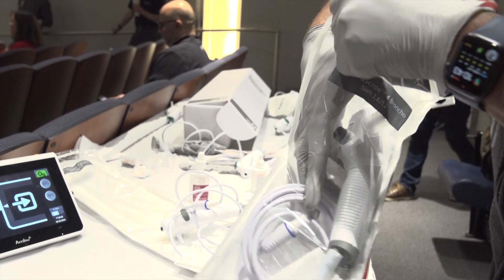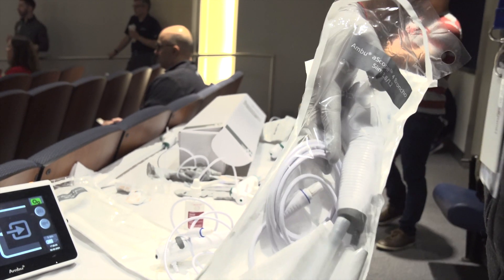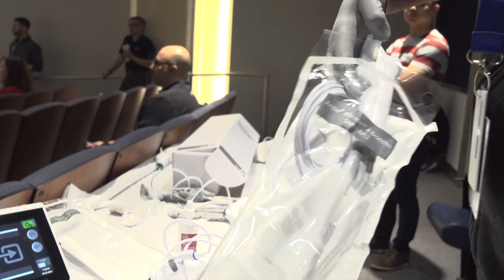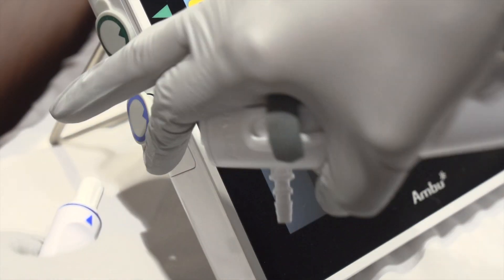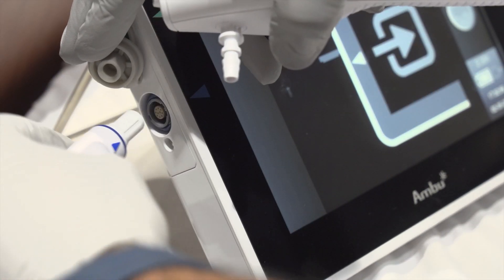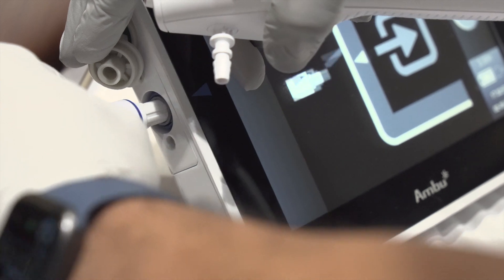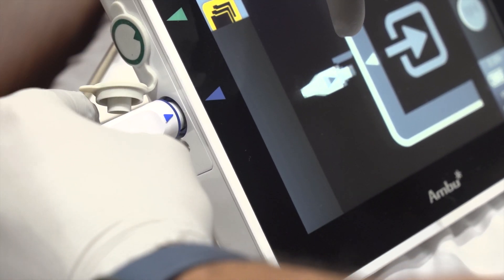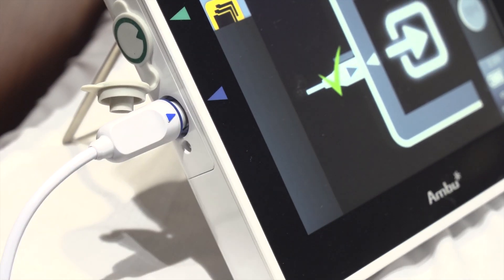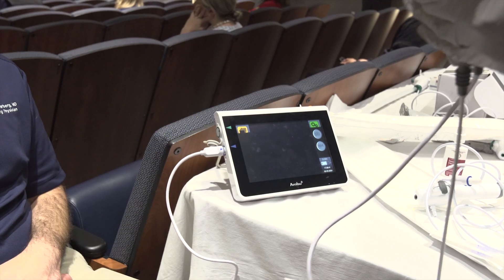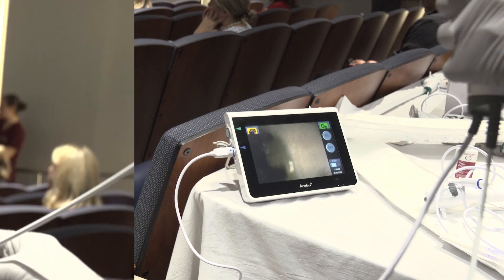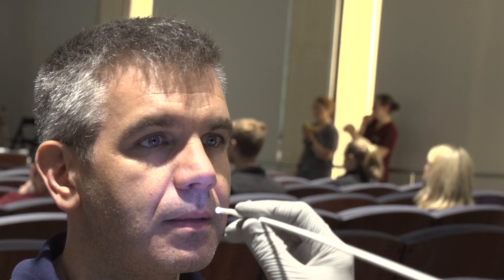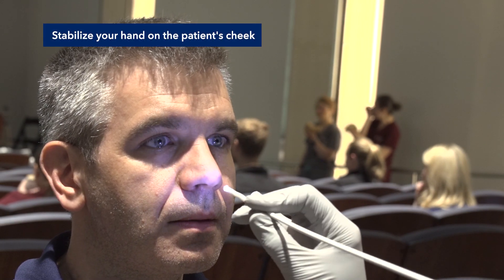Remove the scope from its packaging and connect to the associated monitor. Position your patient sitting upright with their back supported.